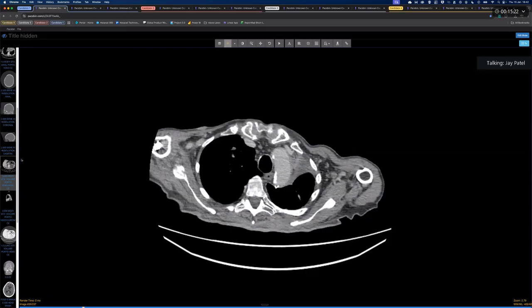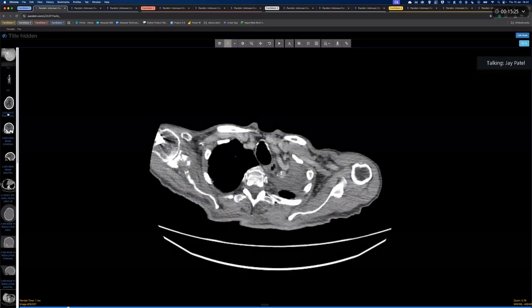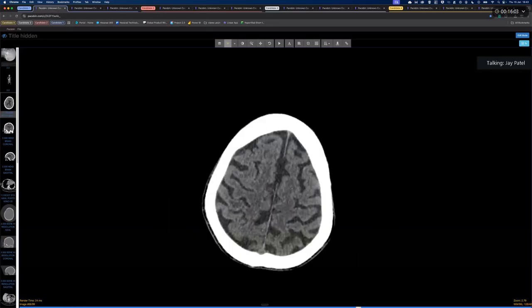Brilliant. I think that's an absolutely brilliant run through. Very nice and clear. One of the things, again, from my observation of the 2B, is that what they want to have is a sensible train of thought. In the case of the post-contrast brain, I'll take you through the imaging in a second, you didn't immediately see those metastases. But I think most examiners realize that in an exam situation, you're not reviewing it at the pace and rigor that you would in real life. What they want to see is a sensible chain of thought, and I thought you did that very well. Well done.